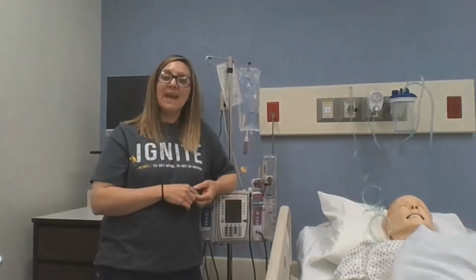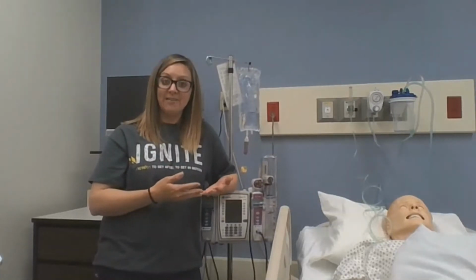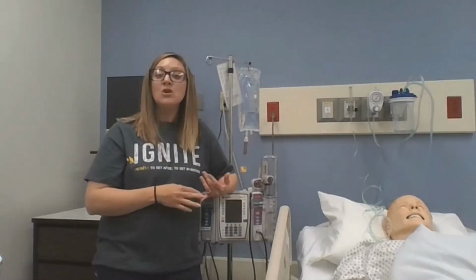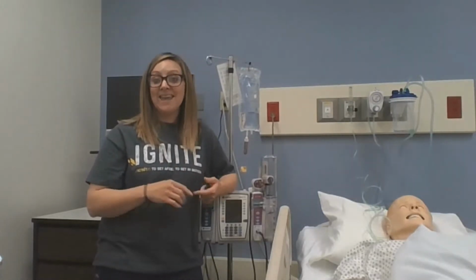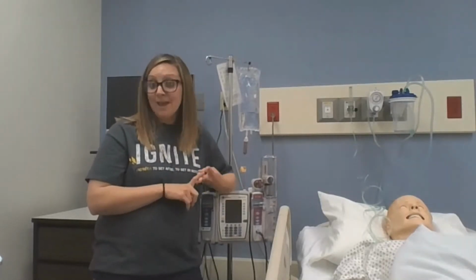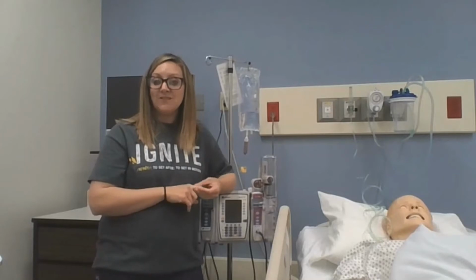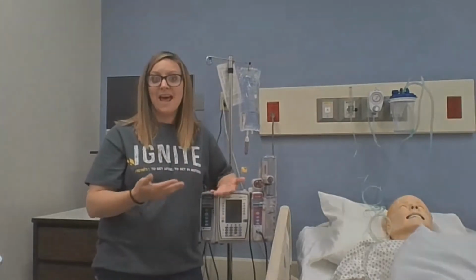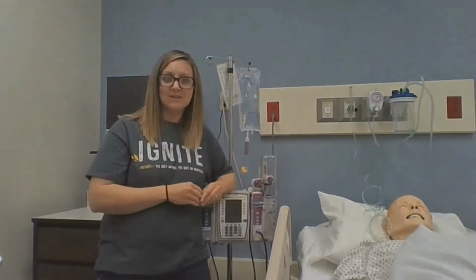If they're on a PCA pump, they can't also have an additional sedative ordered for them because of the risk of respiratory depression. So that means that they can't have Benadryl, they can't have Phenergan, they can't have sleep agents at night. So it's very specific on all of those things, as well as, of course, the obvious ones like Ativan and Xanax and those types of things.